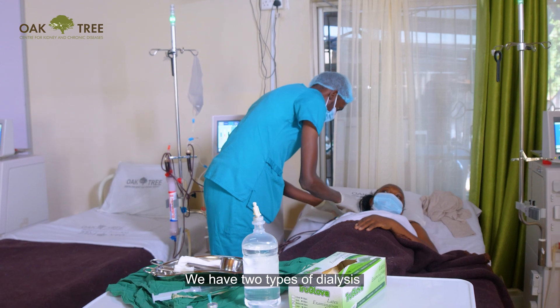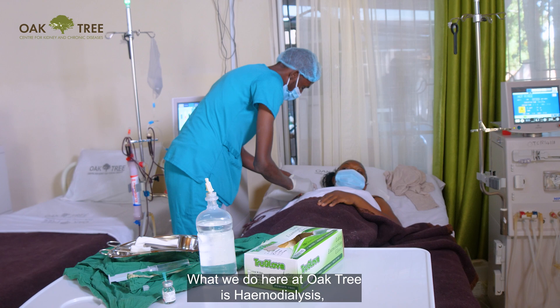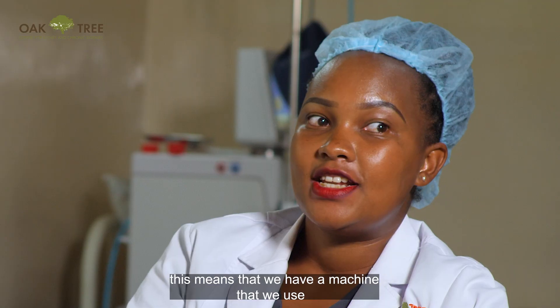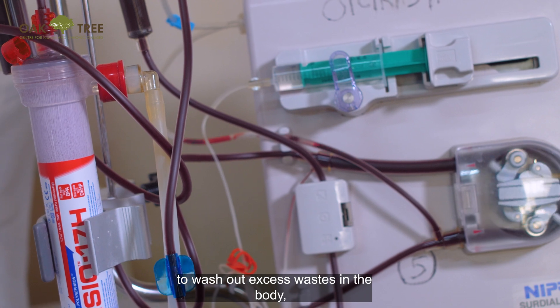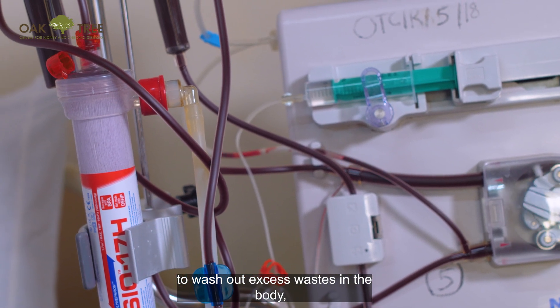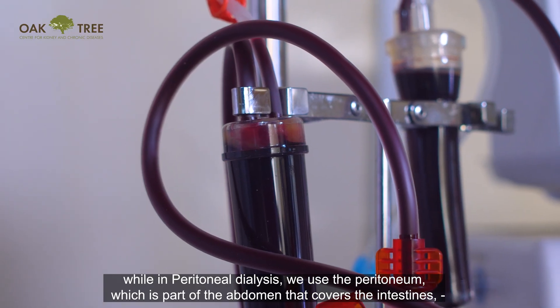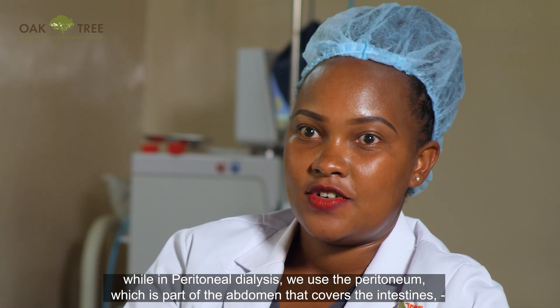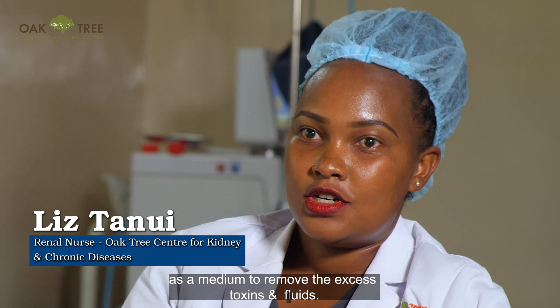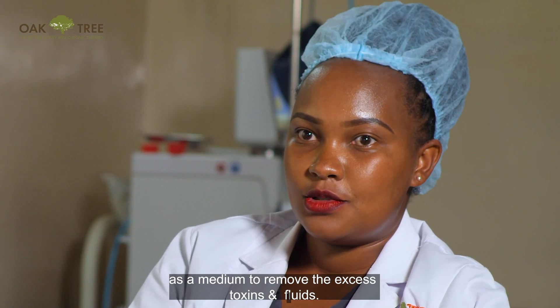We have two types of dialysis: hemodialysis and peritoneal dialysis. What we do here is just hemodialysis. Hemodialysis simply means we use a machine to wash out the excess wastes in the body, while in peritoneal dialysis we use the peritoneum — the part of the abdomen that covers the intestines — as our medium to remove the excess toxins and fluid.